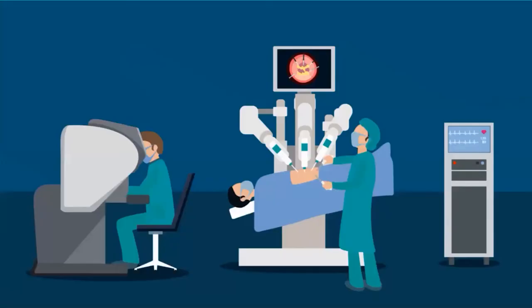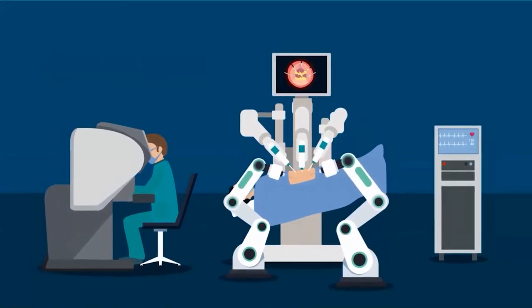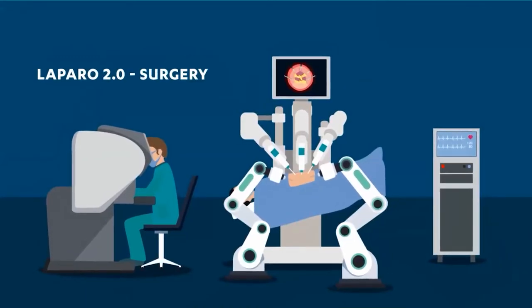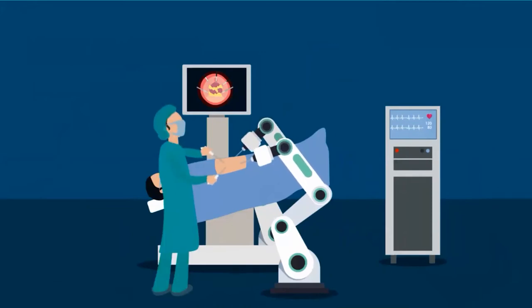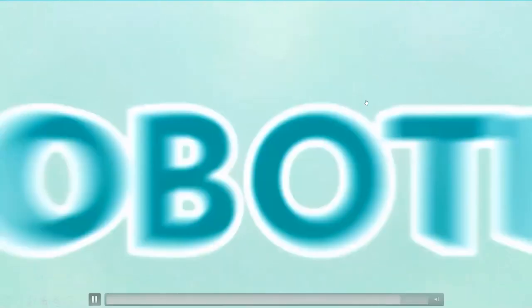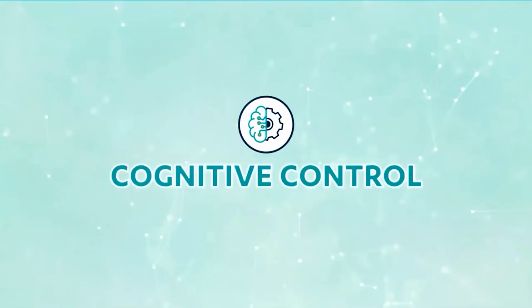In the first one, called solo surgery, the robotic system will replace the assistant, while the main surgeon performs the operation through the console of the commercial robotic system. In the second one, called Laparo 2.0 surgery, it will play the role of the assistant, while the main surgeon uses standard handheld laparoscopic tools. Therefore, SARAS multi-robot surgery is the first step towards the next generation of surgical robotic systems, merging artificial intelligence, computer vision, machine learning, and cognitive control for smarter and safer hospitals.